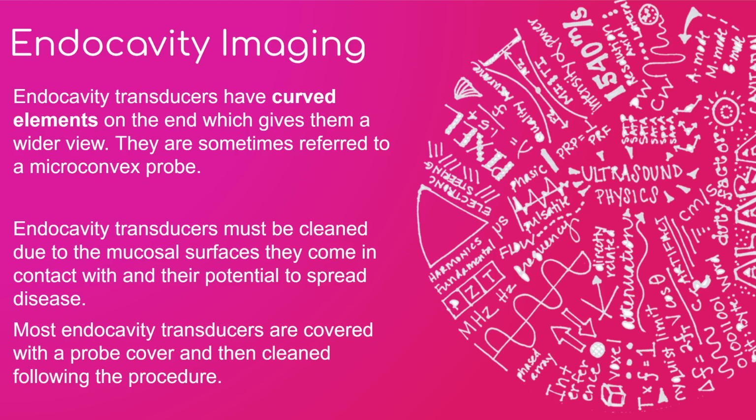So again, those endocavity probes are just taken a step further than our transabdominal probes or transthorax probes that we use.